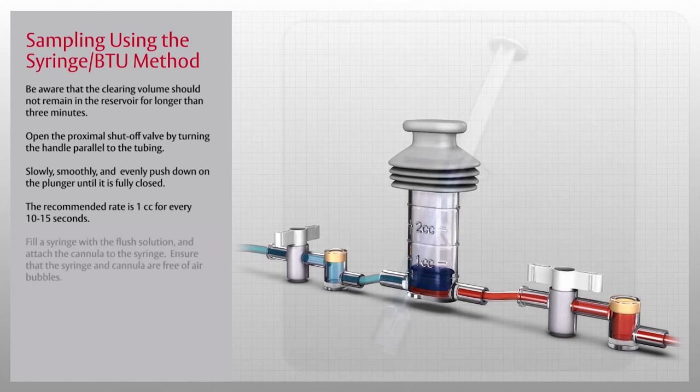Next, fill a syringe with the flush solution and attach the cannula to the syringe. Ensure that the syringe and cannula are free of air bubbles.